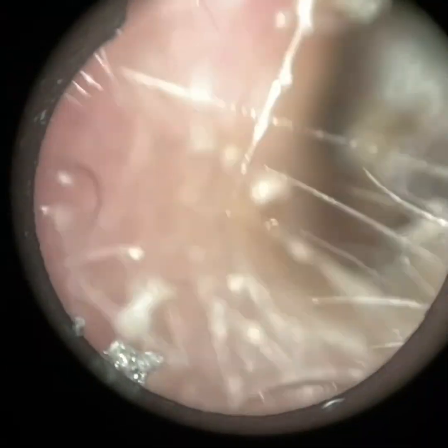Hi everyone, this is Neil Reiteter, consultant audiologist and director of Clearwax. Thank you for joining me in my latest video using the Waxcape. And here we have a patient with bilateral fully occluding earwax, and I'm commencing with their left ear first.